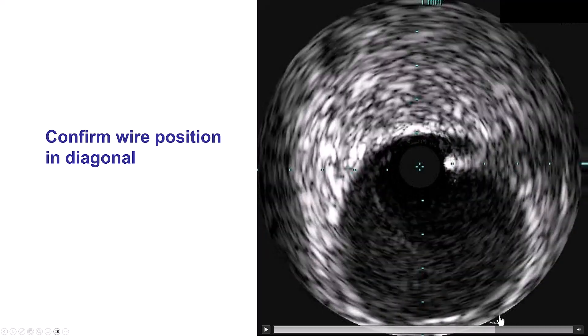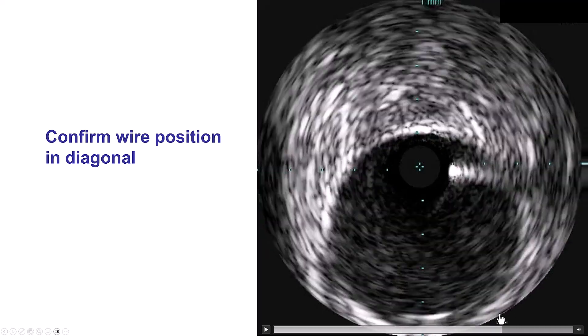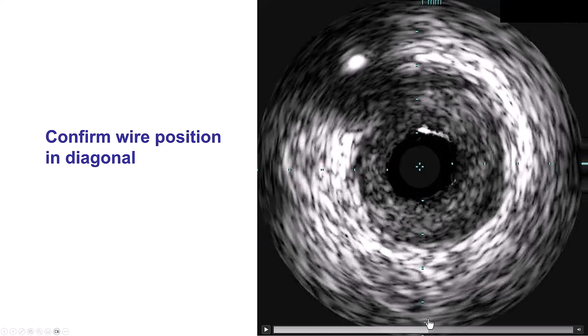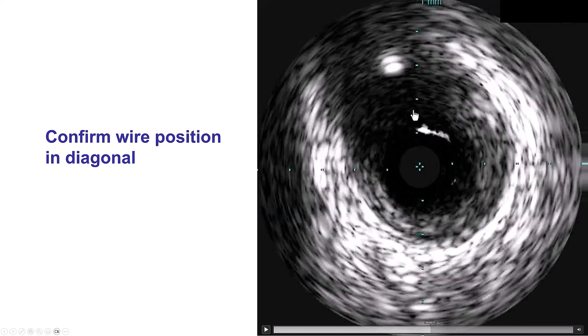In this particular case, we have the IVUS showing us that the guide wire is indeed inside that side branch, which is the diagonal in our case.